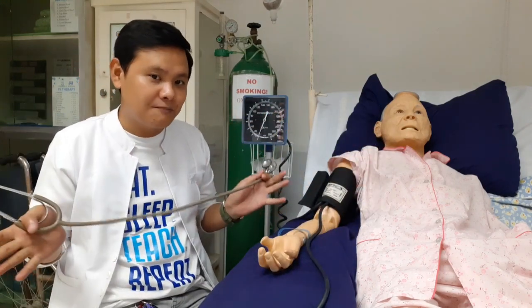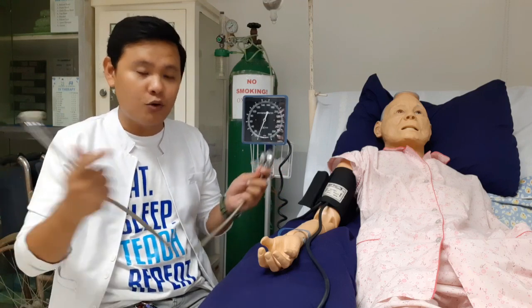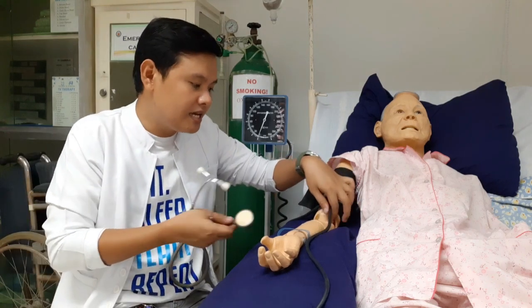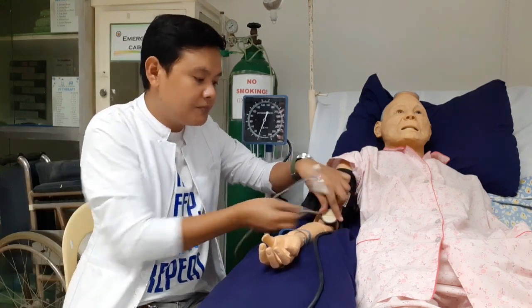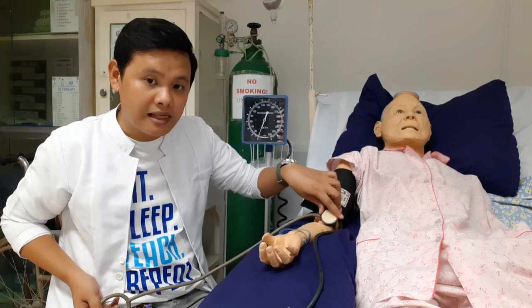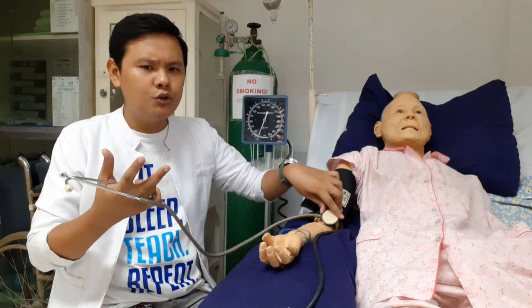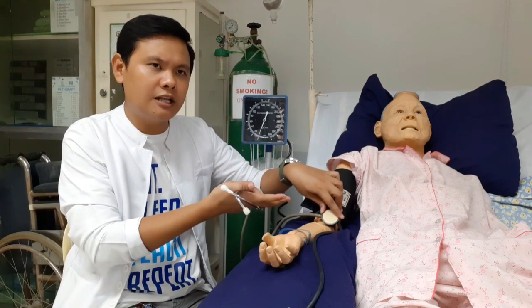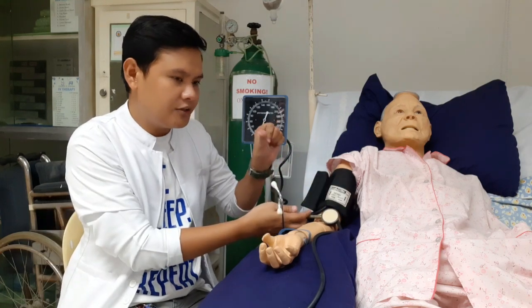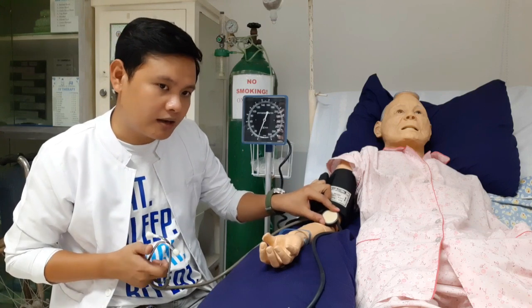No obstruction. Next, you have to place the bell of the amplifier of the stethoscope over the brachial pulse. Since the brachial pulse is here at the side, that is where I will place my stethoscope, I mean, the bell. You have to place the bell over the brachial pulse and then hold it using your index finger and your thumb. This is how to hold it.